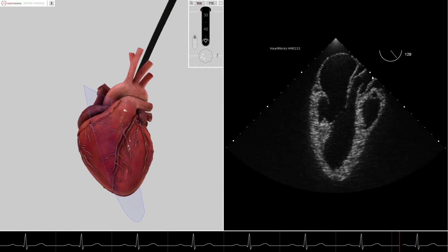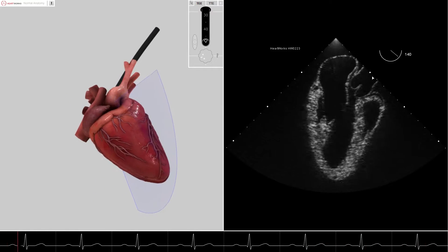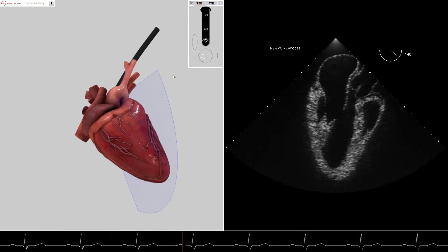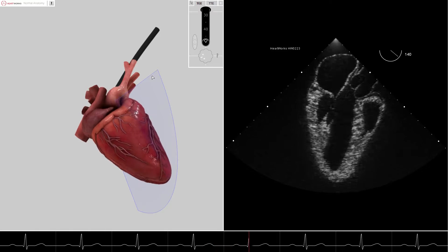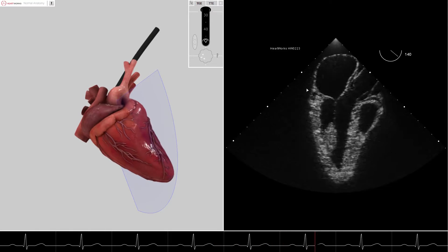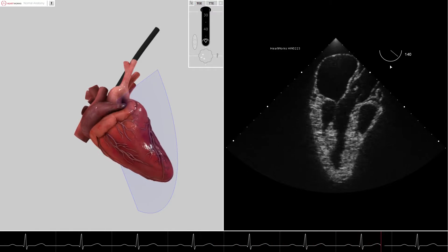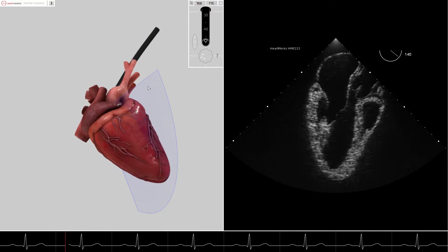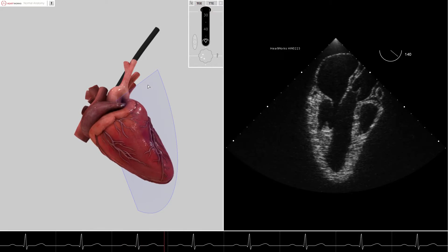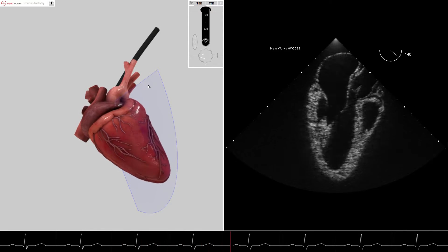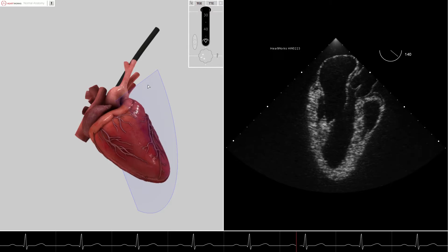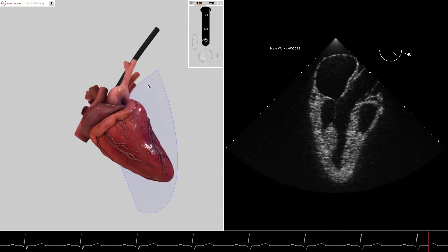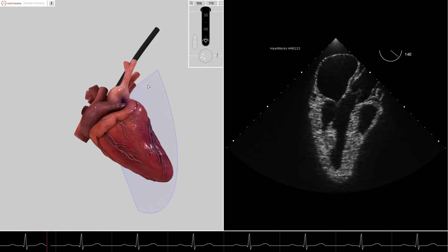Finally, we advance the omniplane to 140 degrees. Again, in this image, the marker side of the cut plane represents the marker side of the 2D image. However, now the marker side of the cut plane has moved from the anterior wall of the left ventricle to the anteroseptal wall of the left ventricle, and now includes the aortic valve and ascending aorta.